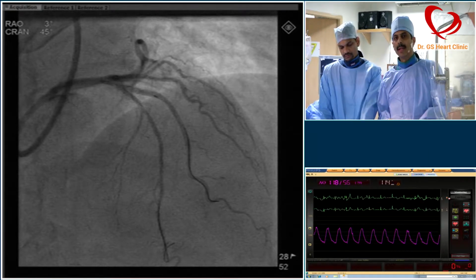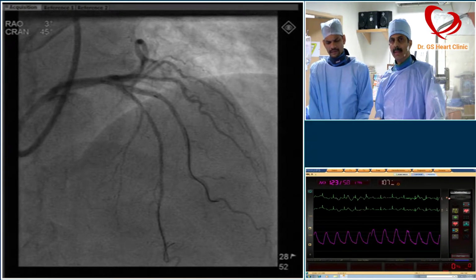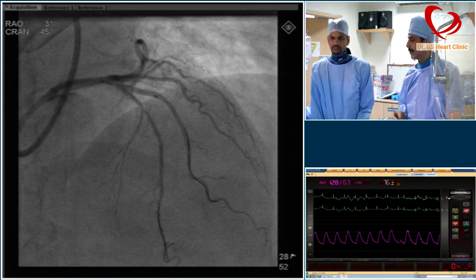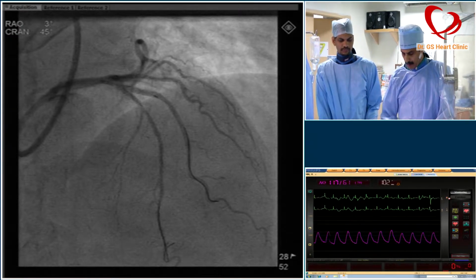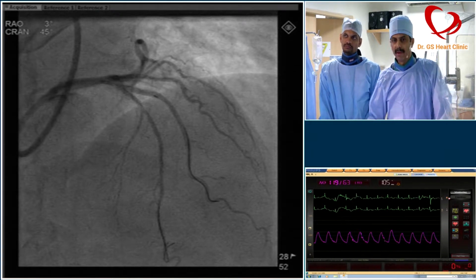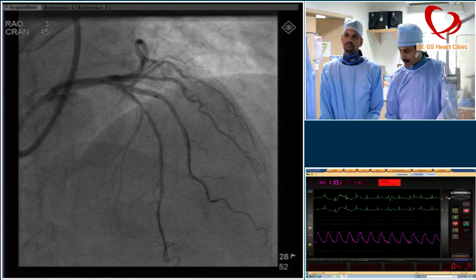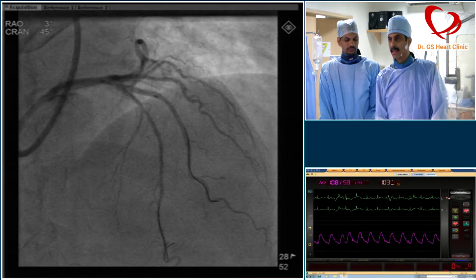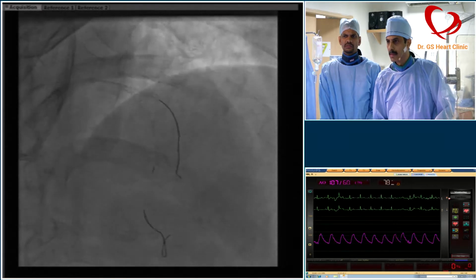I would like to do a 2.5 stent, and then take it up to 3 millimeter approximately, so that we don't have some size mismatch distally, and I will go up with a 3.5, approximately 3 or 3.5. So can you give me another balloon, and we will wire this and then take another stent. Now this is the diagonal wire. I'm going to remove the wire.